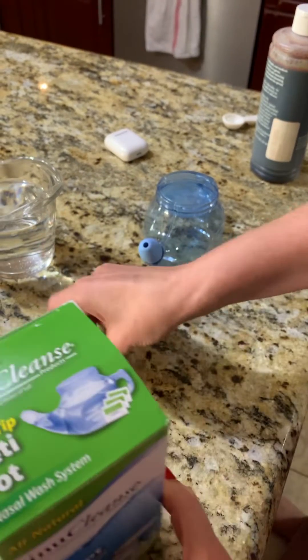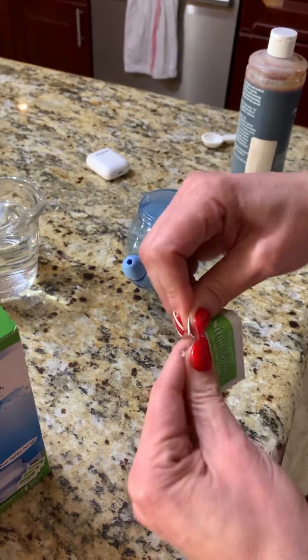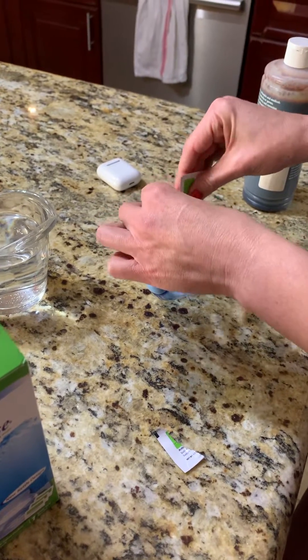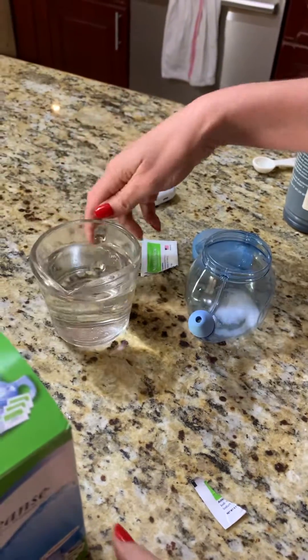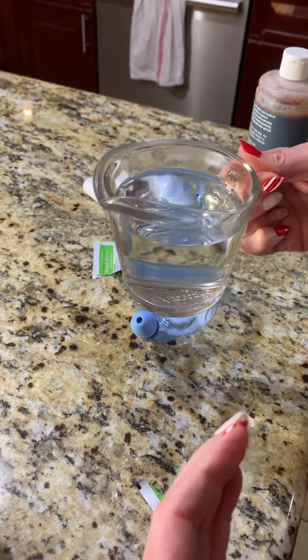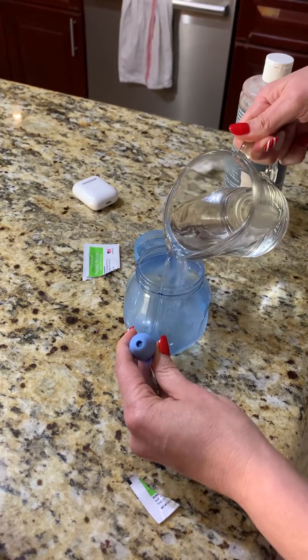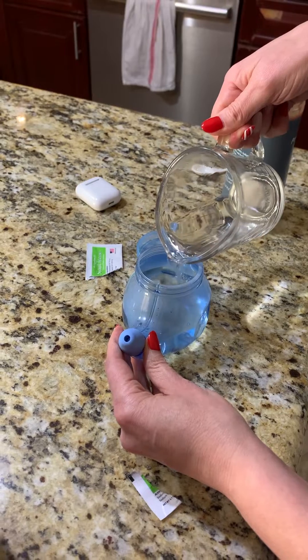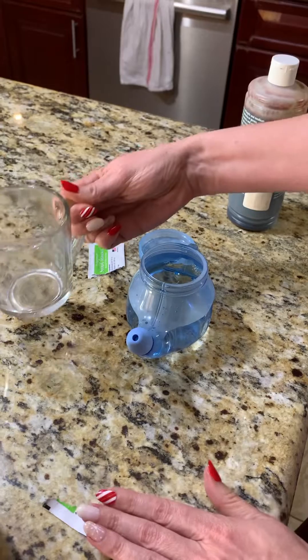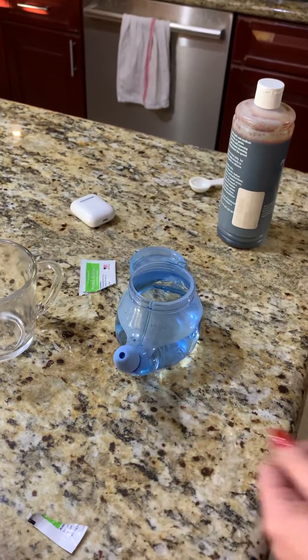It comes with these saline packs. You use one saline pack with 240 mls of sterile water. What I like to do is microwave my water and make sure it boils — obviously you don't want to use it when it's boiling, you want it at room temperature or skin temperature. I like to heat it so the saline melts a little bit faster. So again, that is 240 cc's, pretty much a cup of water, and the salt has already dissolved.